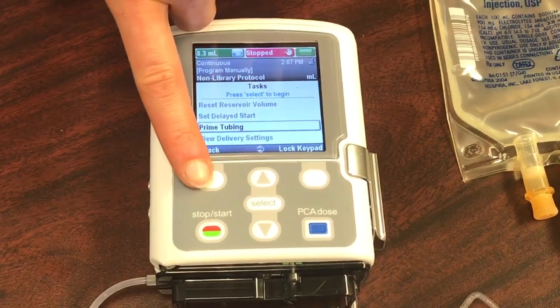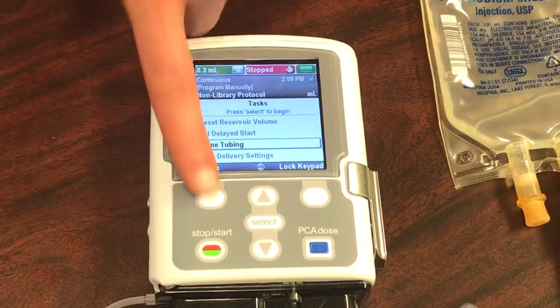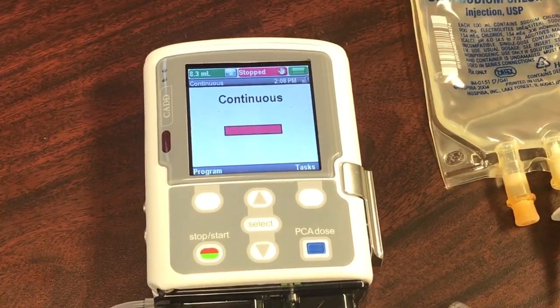After you finish priming, go ahead and go back to the home screen so you're able to start your infusion. To go back to the home screen, press Back and it'll take you back to the home screen.